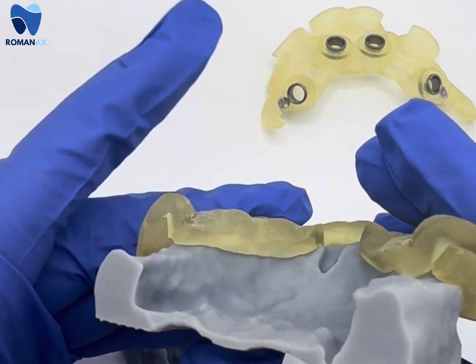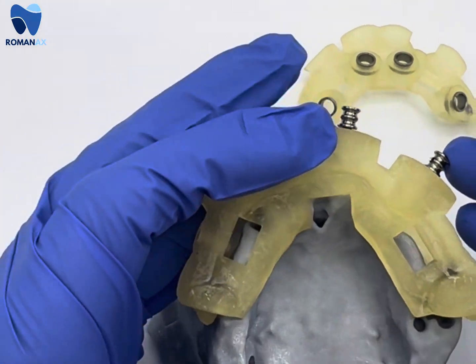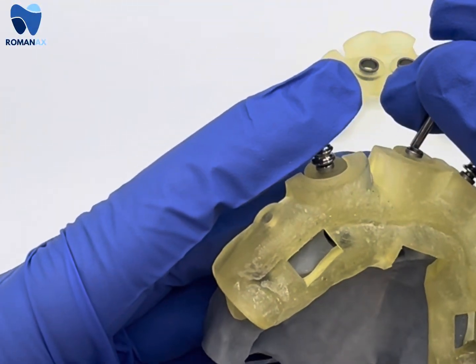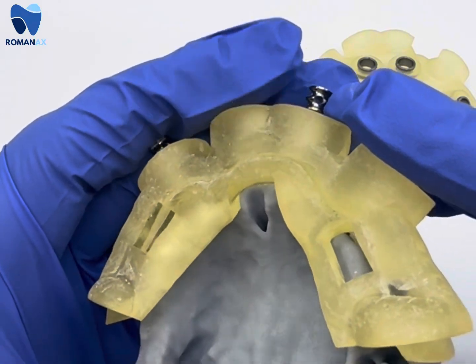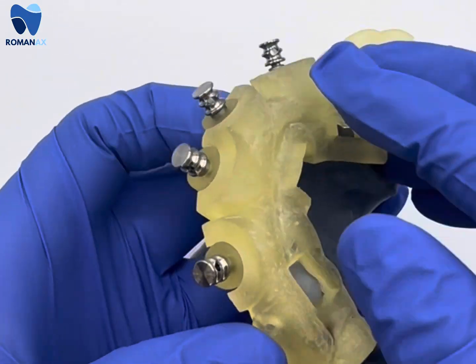Here you see a nice intimate fit. We have windows cut out of the pin guide to ensure that all of the seating and all the surfaces are flush with the pin guide in our reduction guide.